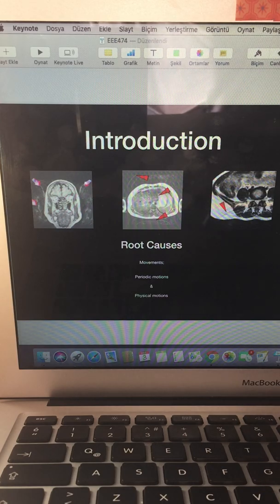There are several examples of ghost artifacts in figure 1. We can see the ghost artifacts illustrated by the arrows. Fortunately, the original image is not disturbed by the ghost artifacts. They do not intersect, so they don't affect the image quality. In the second image we see the ghost artifact in the phase encoding direction on the abdominal region. In the last image, the ghost shows a repetitive ghost effect, and it gives us intuitive information about the reason for that. The prediction is breathing while scanning.